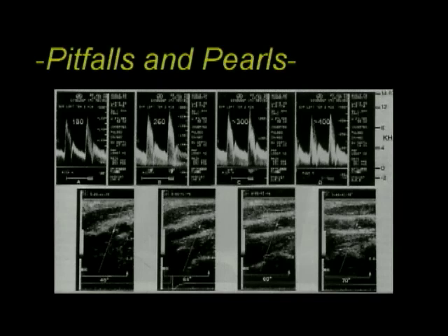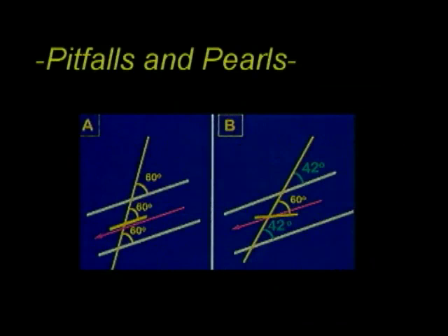So I think this very clearly demonstrates that there is significant variation in the acquisition of the velocity when multiple different angles are used. And this is a strong, for me, indication to use a consistent Doppler angle. In our lab, that would be 60 degrees.